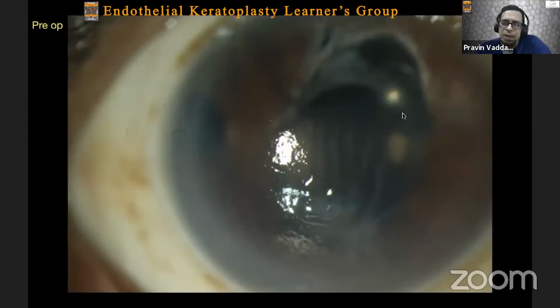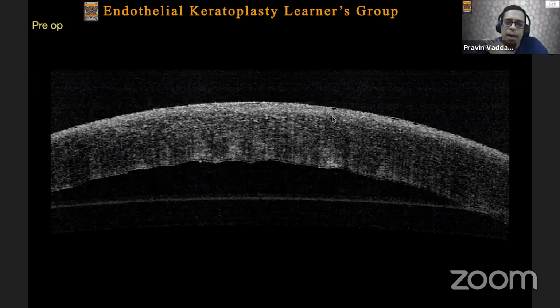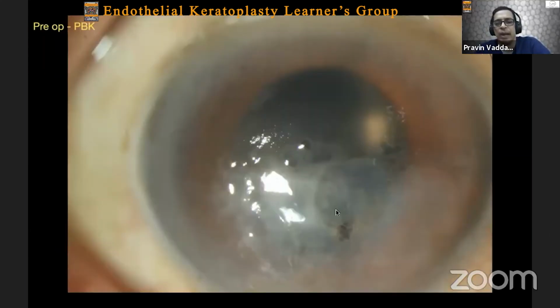More severe cases tend to present after cataract surgery, and in this case, you also will see that there seems to be some damage to the iris, and there probably was a traumatic surgery, though the IOL is present in the bag. What you will see in these cases are more significant bullae, and you will have to deal with a larger pupil. You can see similar findings with intraepithelial edema on the OCT. And again, in these kinds of cases, this is a post-DSEK, you do expect that you will have some residual scarring, especially in the area of the bullae. And in these cases, visual acuity might not improve to the complete extent of 20/20.